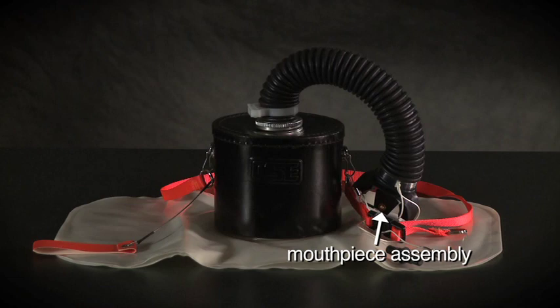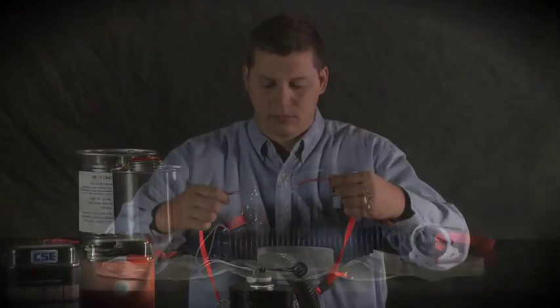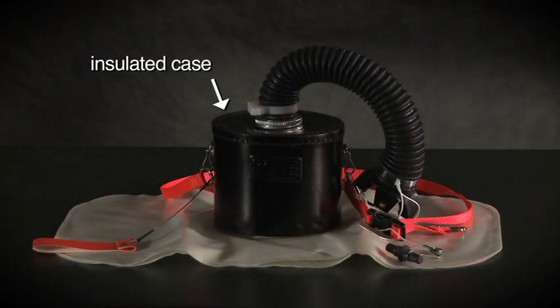The main components of the SRT are: a mouthpiece assembly that features the same mouthpiece, mouthpiece plug, breathing hose, and nose clamp used on the full-scale SCSR; a breathing bag that stores oxygen until you need it and operates in the same way as the SCSR breathing bag; a canister assembly containing a chemical that generates oxygen when your breath activates it; a neck strap that supports the SRT; and an insulated case that protects you from heat produced inside the training canister and provides attachments for the neck strap.